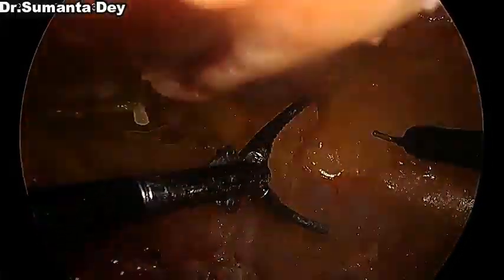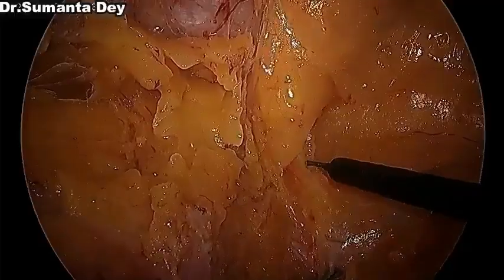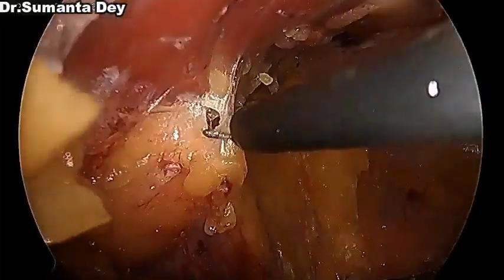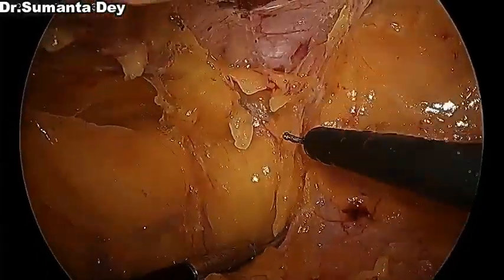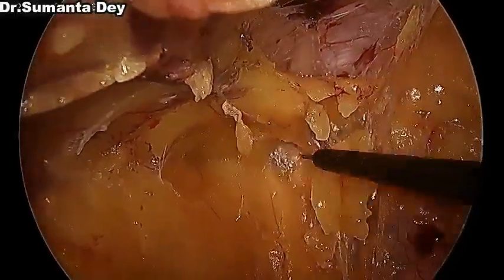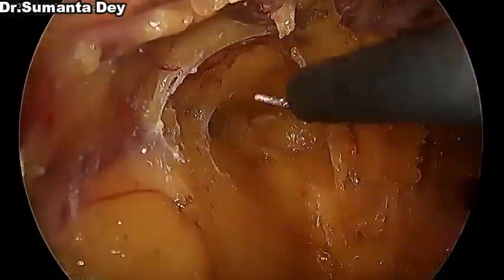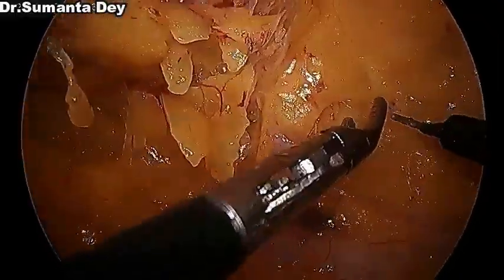So you can see there is a very good amount of preperitoneal and lateral abdominal wall fat over there, and here the peritoneum is thick and loose also. So that once you have entered into the groin, the lifting of the peritoneum is much easier. And here you can see that I am bringing all the fat down along with the flap, so that both the recti are bare. And also you should take care that there are inferior epigastric vessels of the right side underneath the right rectus muscle. Here you cannot see my left hand instrument, but it is consistently giving a good amount of downward traction.